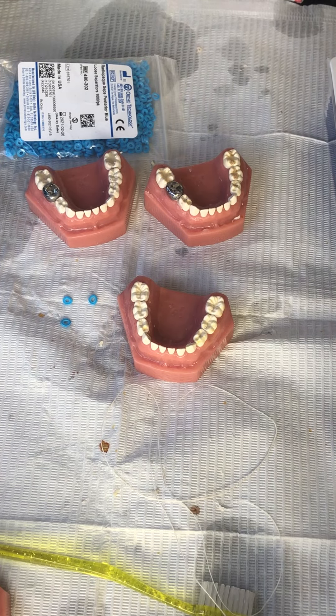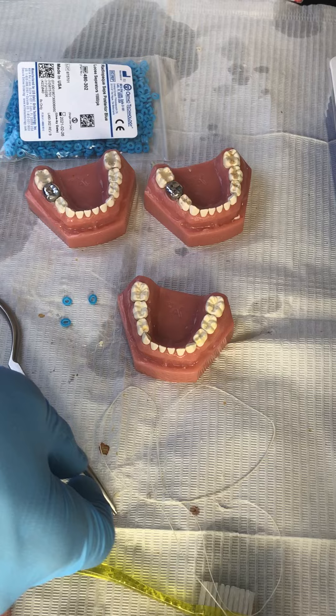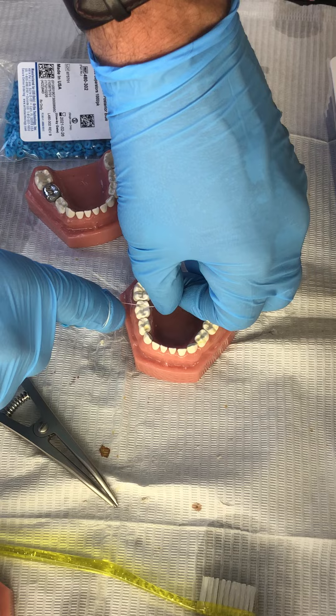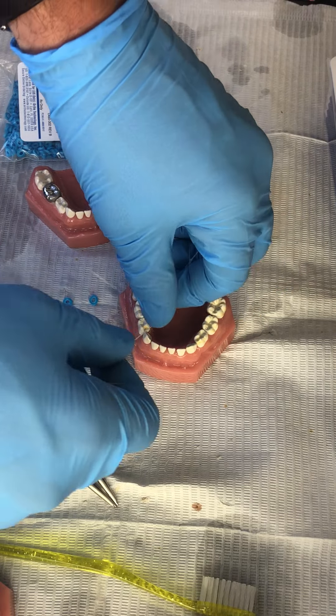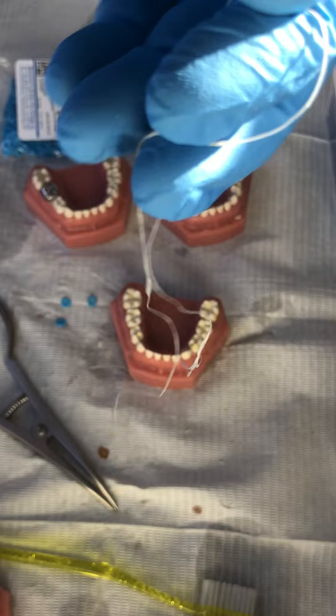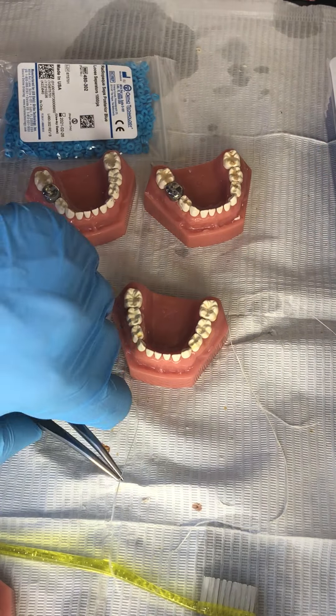Hey friends! When you're placing a Hall Technique stainless steel crown, sometimes the teeth are too tight together to just apply the crown directly. You want to test that by flossing between the teeth and getting a feel. If the teeth are really tight together from your floss, you probably want to put a separator in and have the patient back three to seven days later.